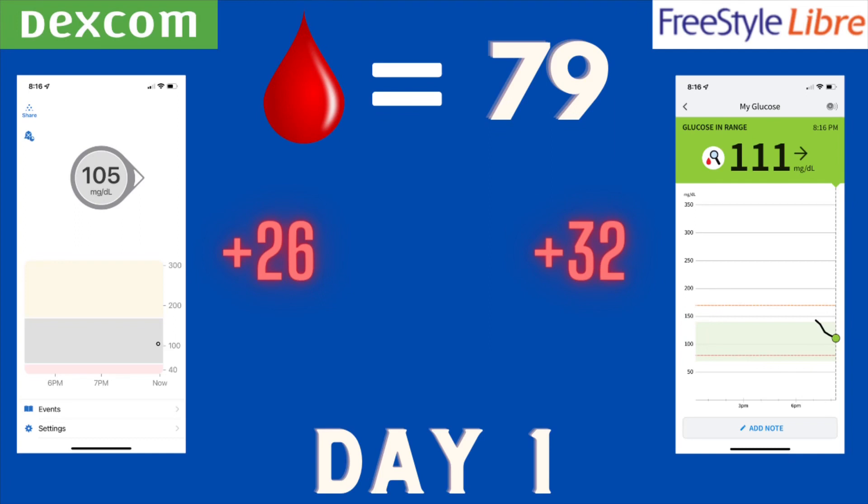Day one — this was when I just put the sensor on, two hours in. We all know that the first 24 hours the readings are not very accurate; that's a known thing with these sensors. The finger stick was 79. The Dexcom gave me a 105 — 26 points off. The Libre gave me a 111 — 32 points off. Pretty similar, not much of a difference, but the Dexcom did have a little bit of an edge.